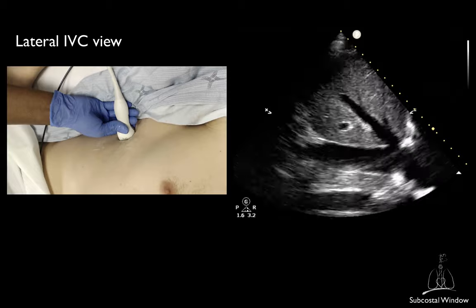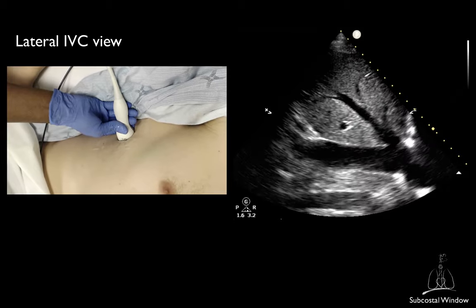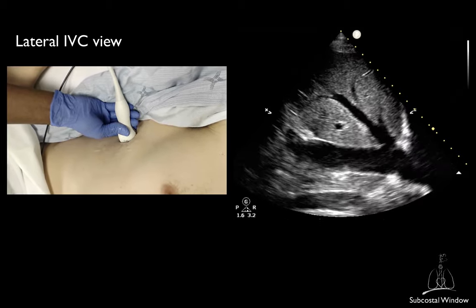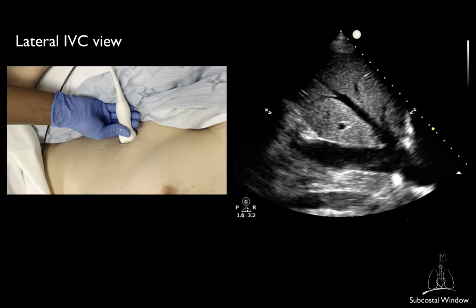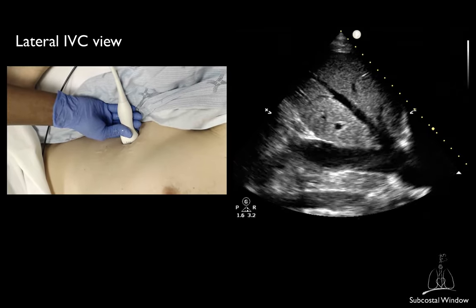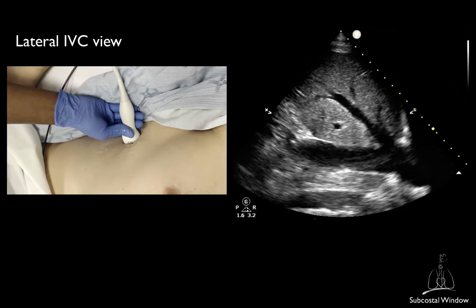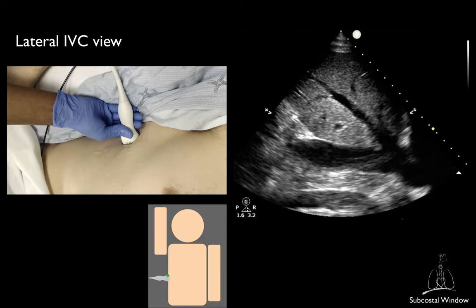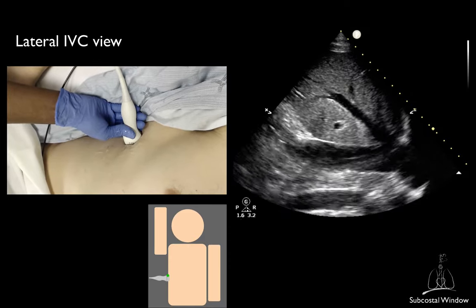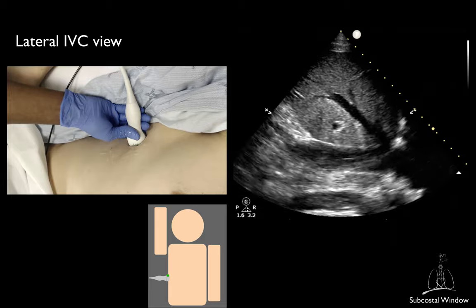For patients who underwent laparotomy, the subcostal view may be inaccessible, and you may want to try to obtain the IVC view from the lateral side. Use the liver as a landmark. The marker should be aiming cephalad. You may have to change rotation to be able to image the long axis.